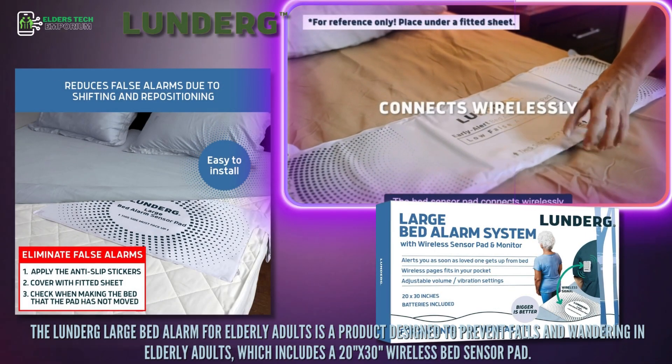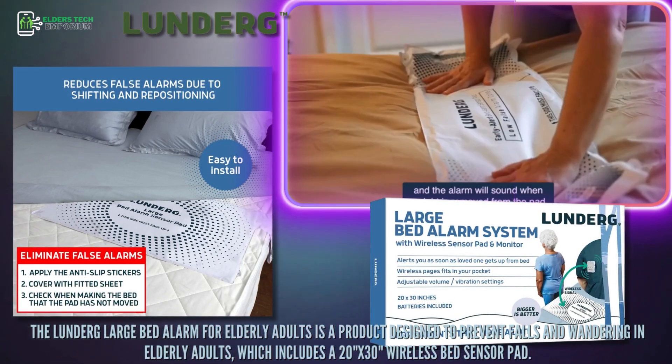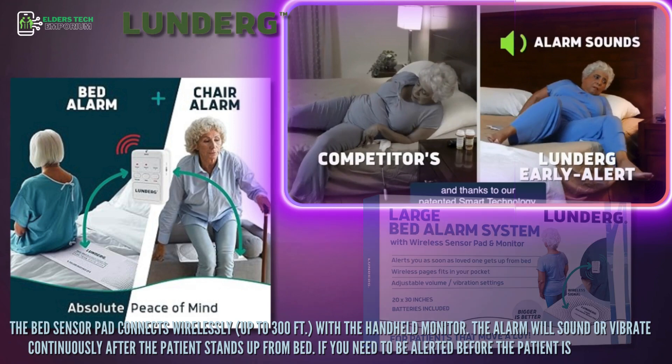It includes a 20 inches by 30 inches wireless bed sensor pad. The bed sensor pad connects wirelessly up to 300 feet with the handheld monitor. The alarm will sound or vibrate continuously after the patient stands up from bed.